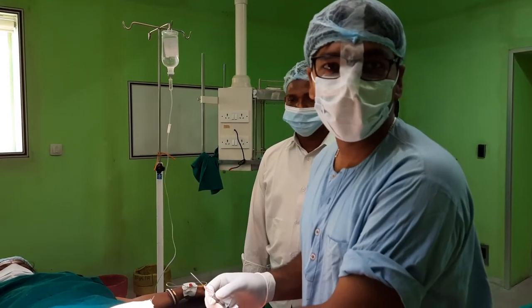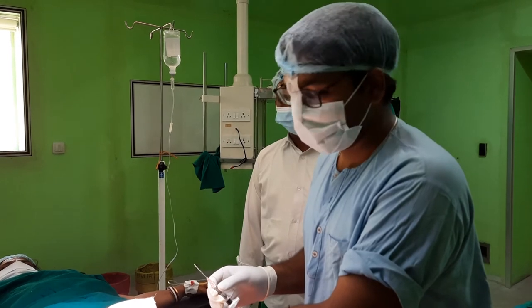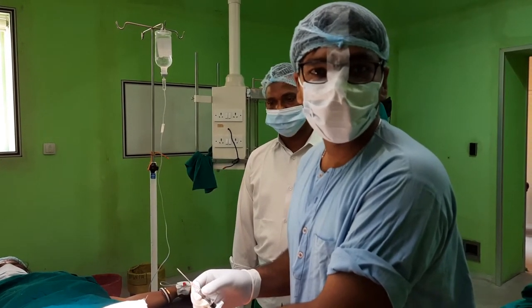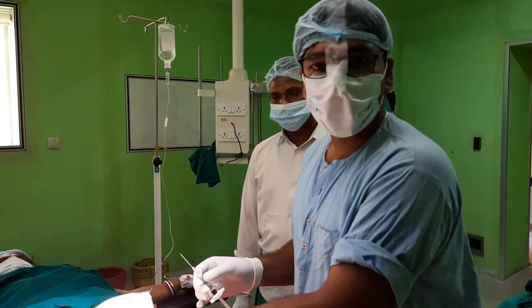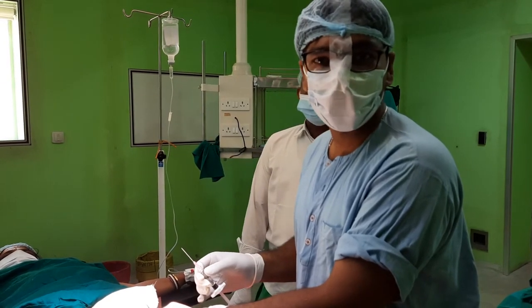Today we are going to demonstrate a very common — or rather, very recently practiced — procedure: the intra-articular injection of viscosupplementation, that is sodium hyaluronic acid, in a case of osteoarthritis of the knee involving both sides in a 47-year-old female patient.